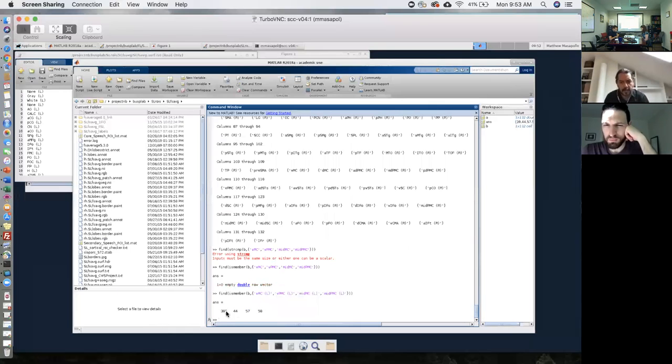The 39 corresponds to ventral motor cortex left, and 44 corresponds to ventral premotor left, and so on. And we could have done that manually, basically looking at the lines corresponding to that. This perhaps is a little bit more complicated, but it's also more general. So whatever number of different ROIs, you can use this syntax to figure out these numbers semi-automatically.